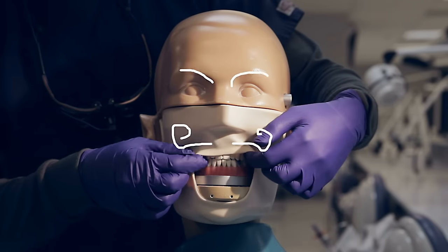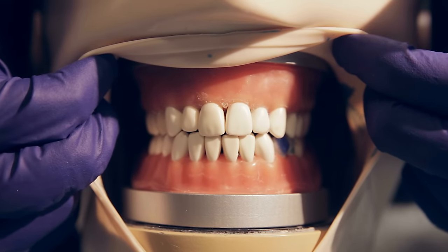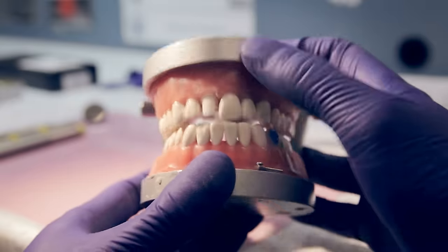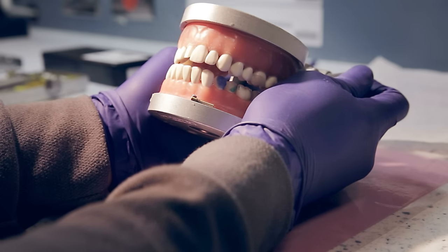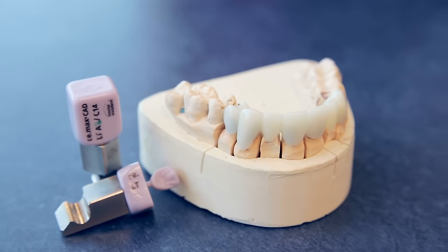Today we will be providing Dexter with a number 8 CAD-CAM crown. Prior to prepping, the restorative material should be selected based on aesthetics, occlusal forces, and other factors concerning the patient's original occlusion. For Dexter, we'll be using Emax as our restorative material.